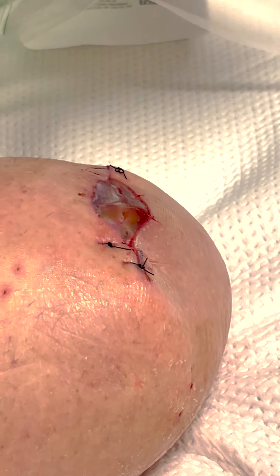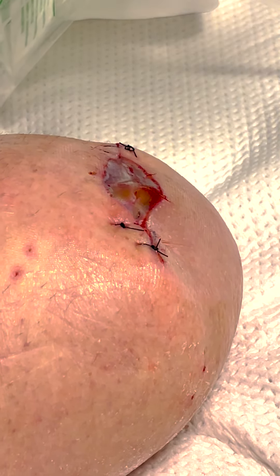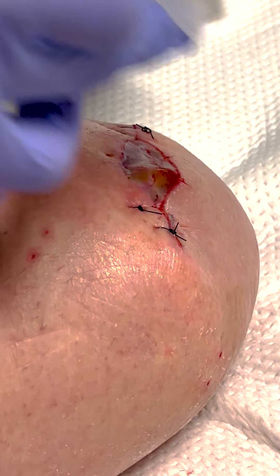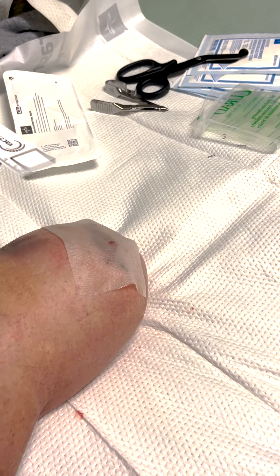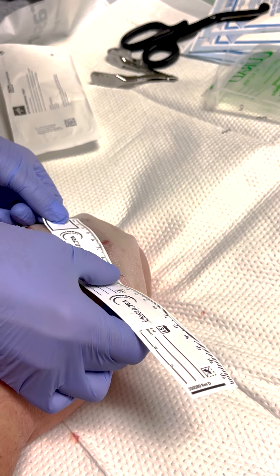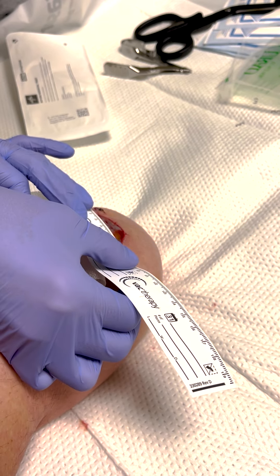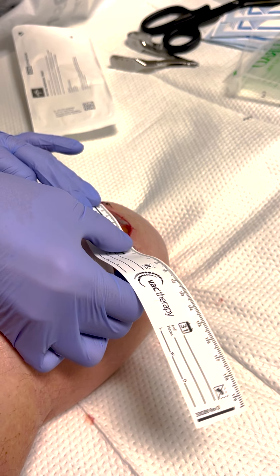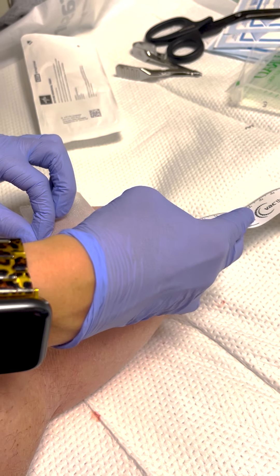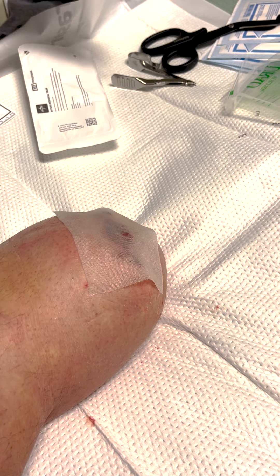The Adaptic can be put on and then the wound vac goes over that. One thing I've learned with the wound vac is the sponge is not supposed to touch your skin because it will irritate the skin very badly. I'm going to change the lens here to get a little wider so we can see what's going on. We've also got to measure the wound. The wound actually looks really good — I'm very happy to see how it looks and how it's not as painful as I thought it would be. I think the pain I was experiencing was from the Adaptic that was stapled to my skin, and every time I moved it would yank the staples a little bit.